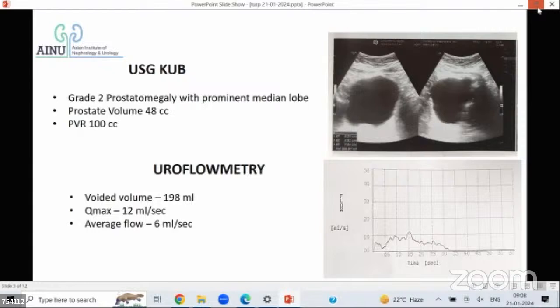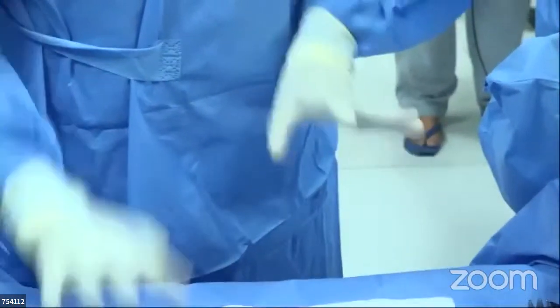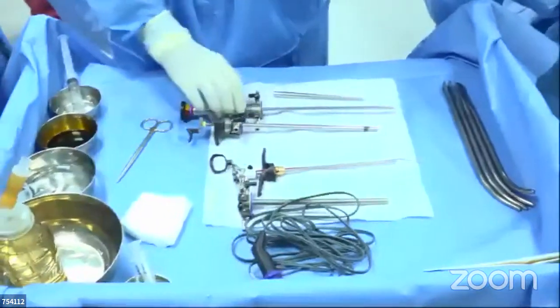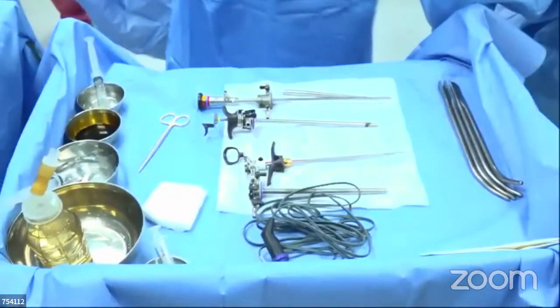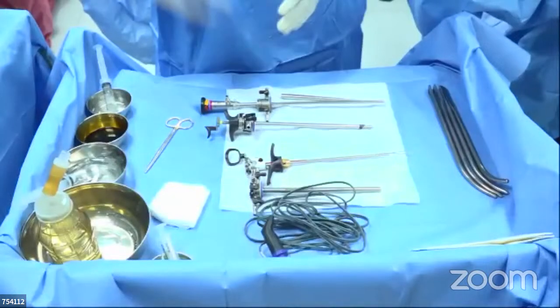So that's a meatal calibrator, a cystoscope, which is mostly necessary. And Mali, you're showing the instruments. We are seeing the slides now. Yeah, now it's fine. What I'm using, I'm just saying it now. All this time the slides were on. Now we are able to see these. Okay. Fine. You got the case material, right?